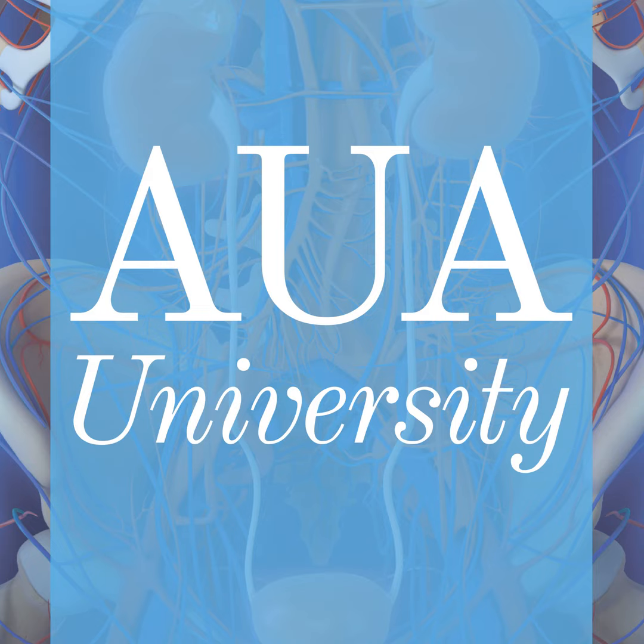What we detected in this situation is a patient who had this type of relapse. So you have the bladder here. You see all the clips nicely after robotic-assisted radical prostatectomy. And then you have this type of locally recurrent disease. What could that be?